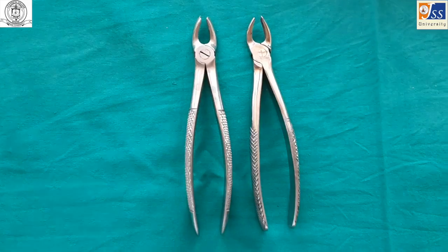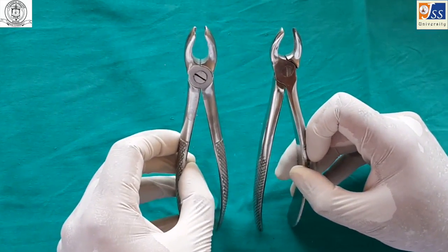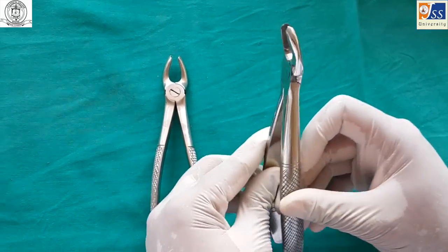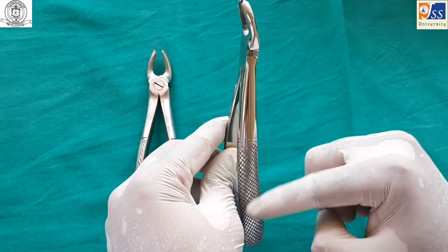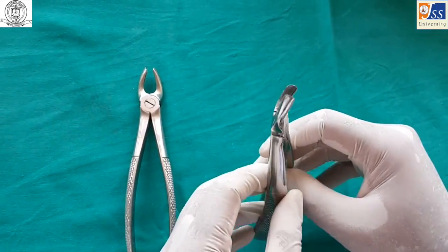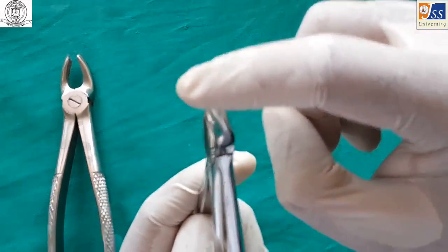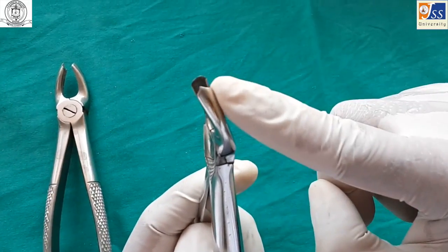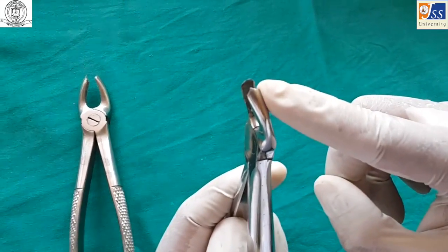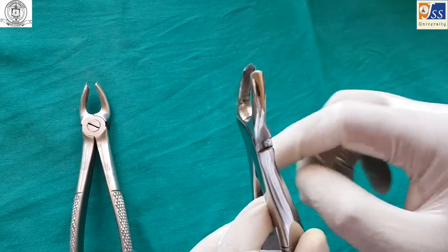Maxillary molar forceps is used for maxillary molars. It is a paired instrument — one for the left and one for the right side. It has a pointed end on one beak which engages the buccal furcation area, determining the side of the forceps. The other beak is smooth and slightly curved to engage the palatal root.